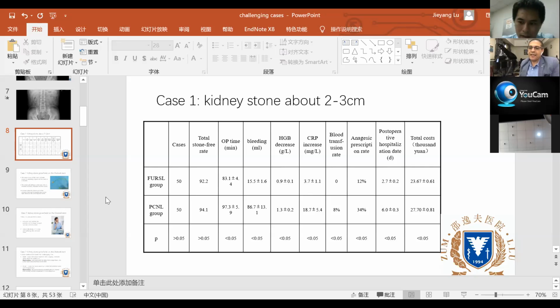Actually, I want to clarify one thing at this point. I think our colleague from Libya is talking about the new thulium fiber laser for stones, and I don't think it is the one you have in your hospital, because it's still new in the market.